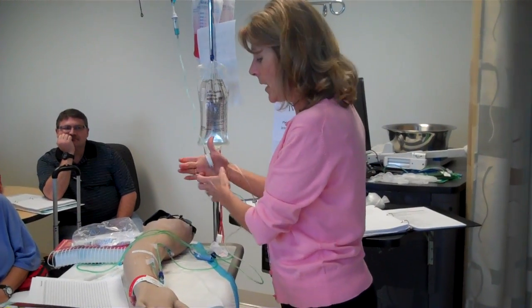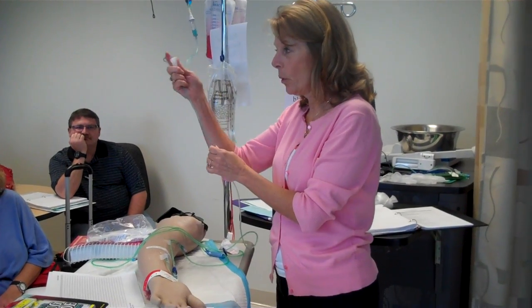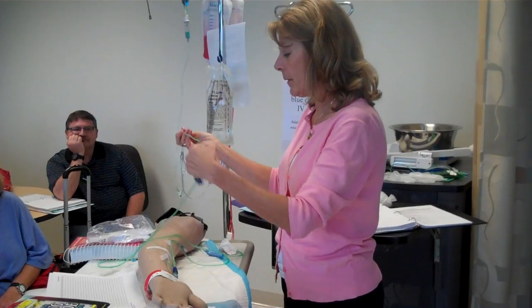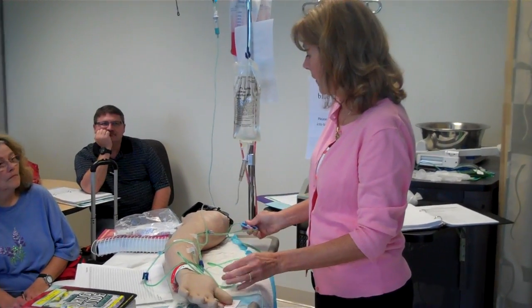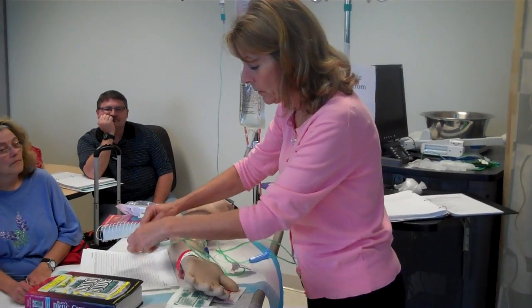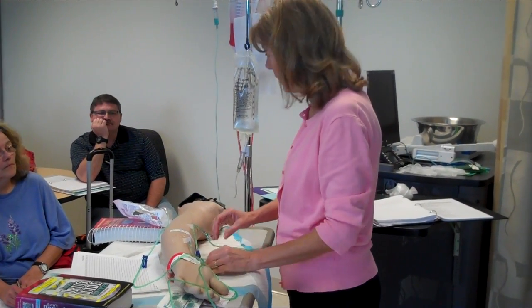Now I'm ready to start my infusion. You totally open this clamp and you use the clamp on the primary to regulate your rate. Alright, let's make sure it's running. Okay, and everything's open.